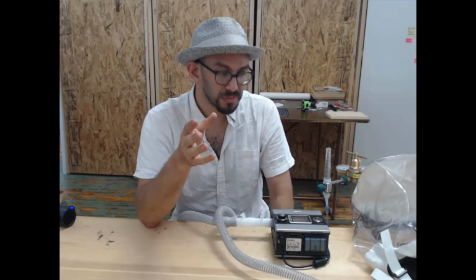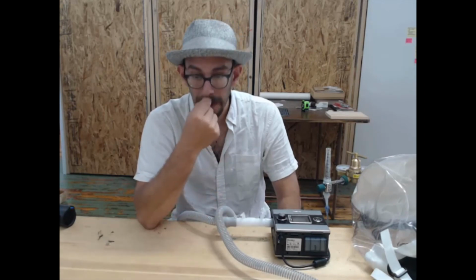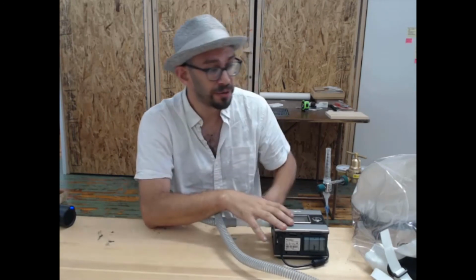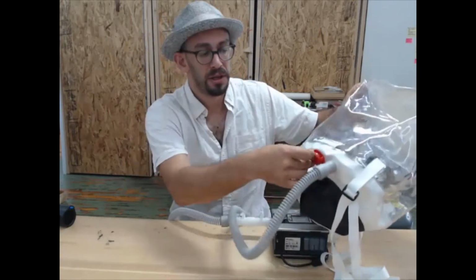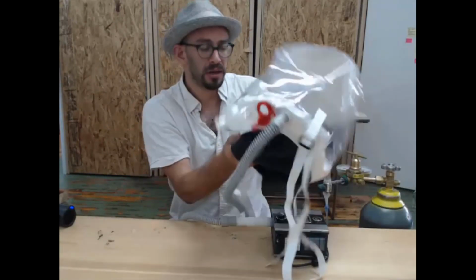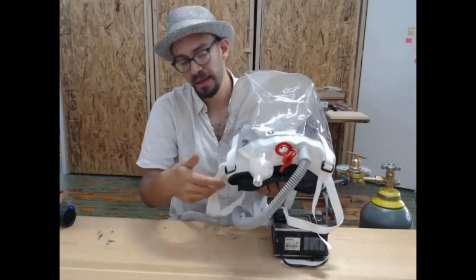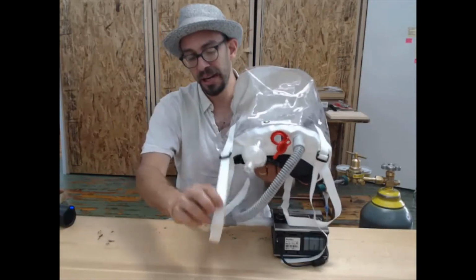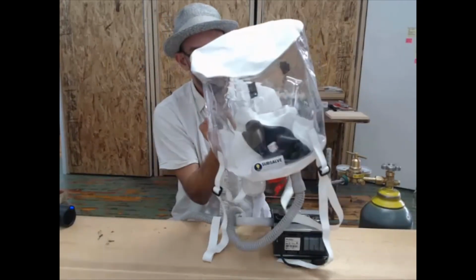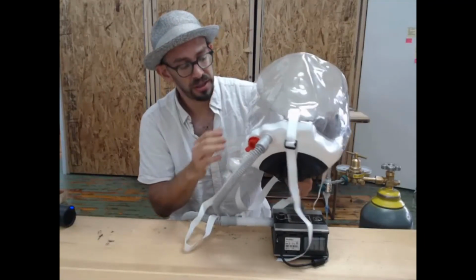Now, I mentioned you want to ensure you have flow going through the helmet before you put it onto a patient. The way to get this onto a patient, go ahead and start your flow. Take your helmet, open this access port, and working with another clinician, go ahead and stretch this neck seal over the patient's head and tighten these straps down under the patient's armpits. So this is important. As soon as this seal makes a seal over the patient and this port is closed, the hood will inflate.